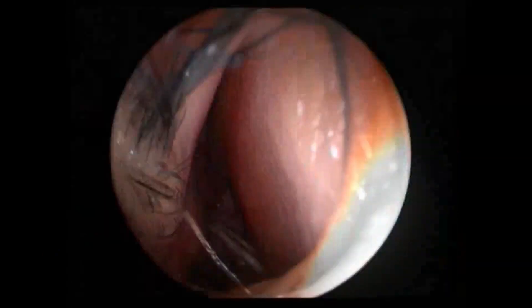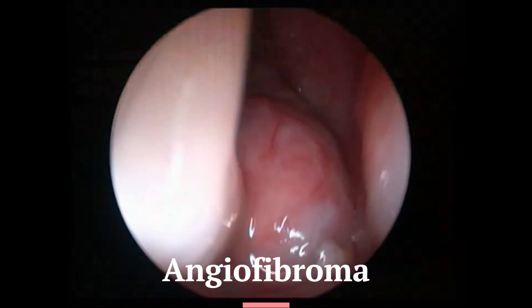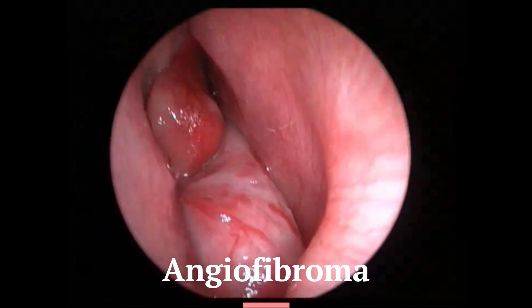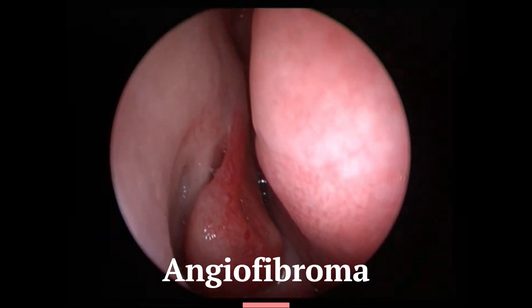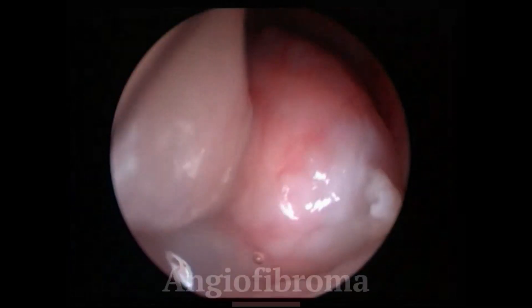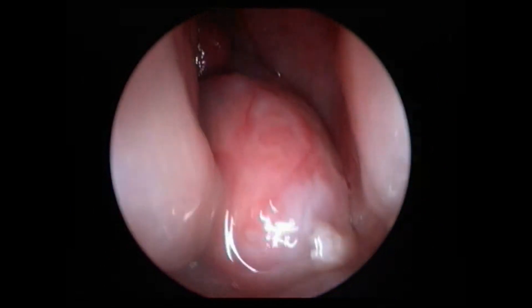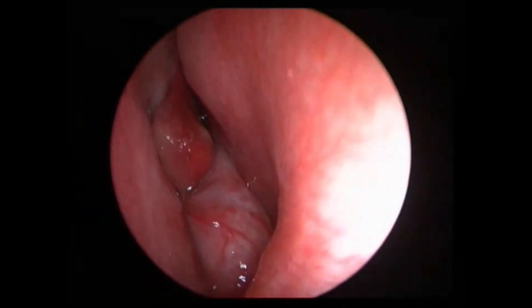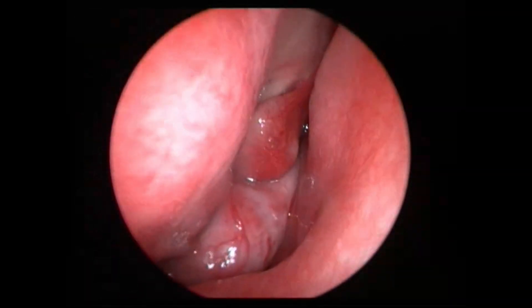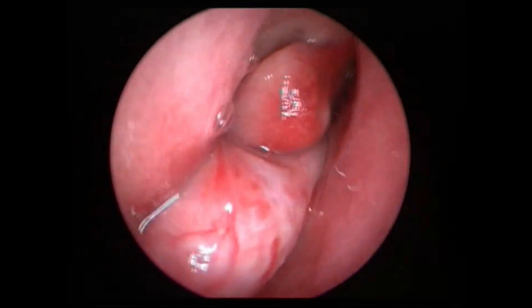Another case: a young male coming with a complaint of frequent nasal bleed, and a firm mass was seen arising from just behind the middle turbinate area — that is the sphenopalatine foramen — coming into the nasal cavity and going into the nasopharynx posteriorly. You can see blood vessels running over this mass, so this was an angiofibroma.